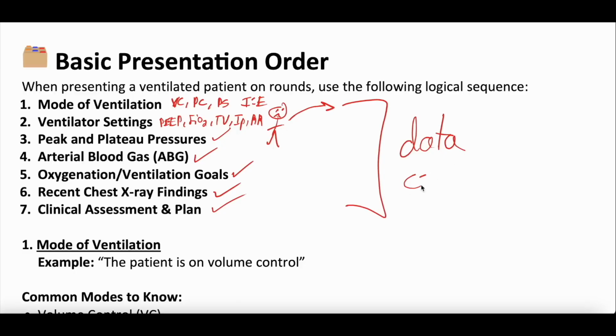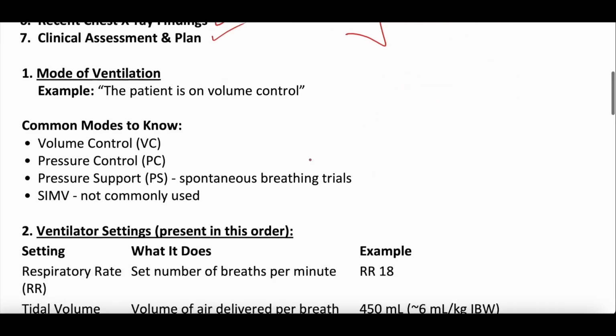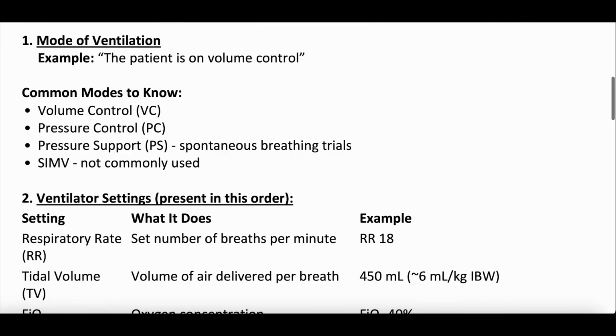These are the things we're going to be talking about in terms of how to collect the data, how to think about it, and how to present it. So if we start with number one, mode of ventilation. The common modes to know, and we've talked about this in the past.